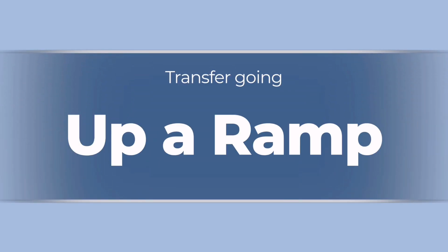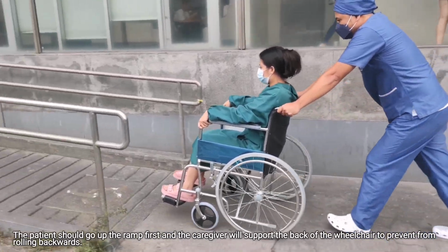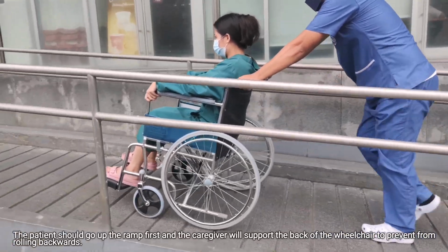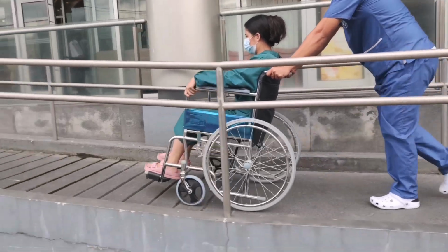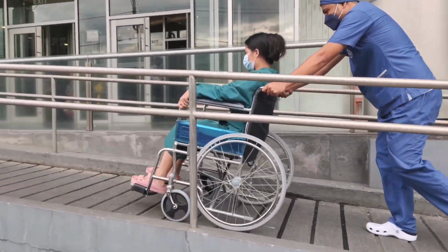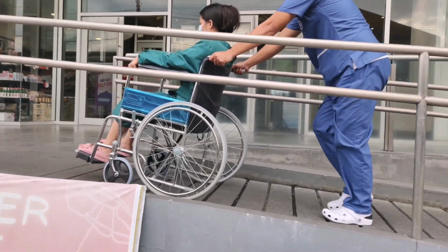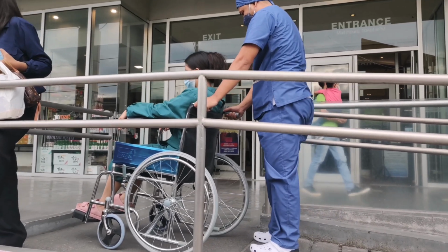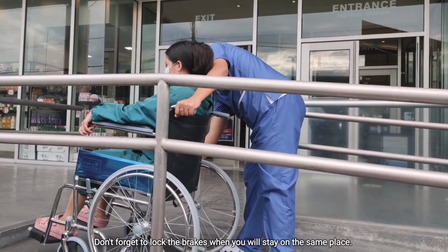Transfer going up a ramp. The patient should go up the ramp first, and the caregiver will support the back of the wheelchair to prevent it from rolling backwards. Don't forget to lock the brakes when you will stay in the same place.